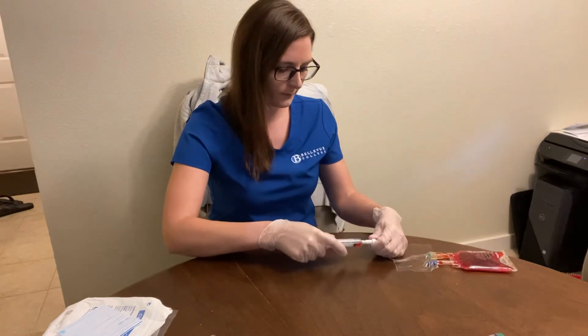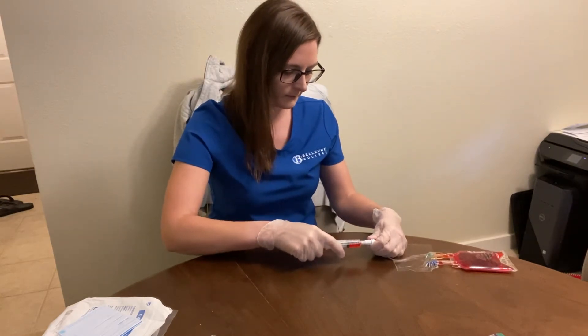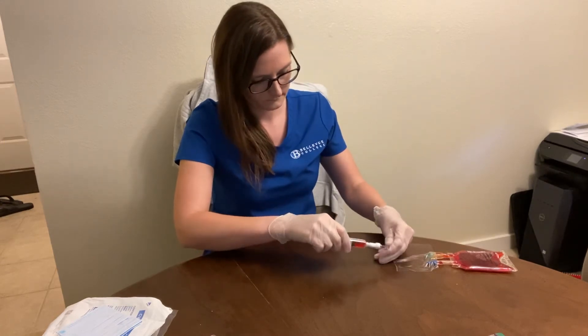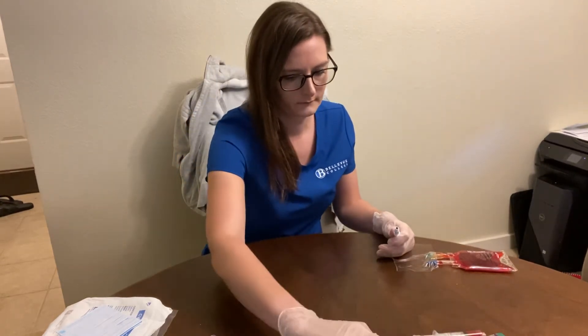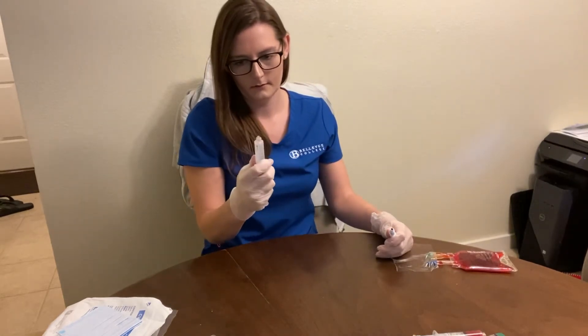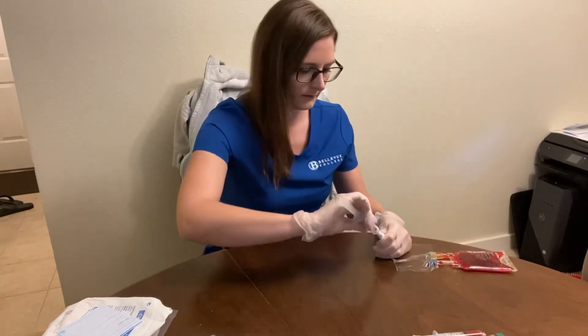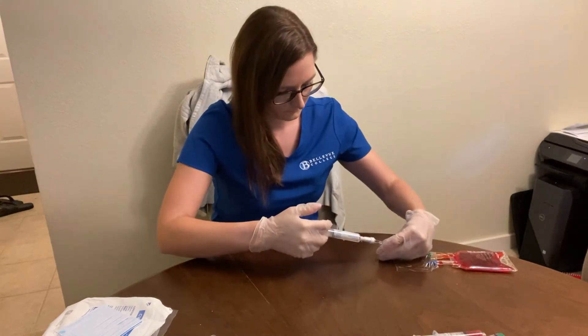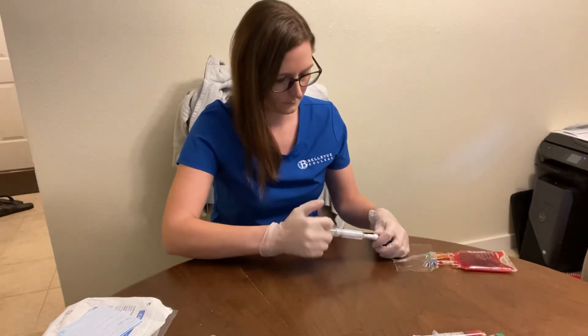I'm going to do my blood draw — about 4.5 ml. I'm going to set that to the side. Then I'm going to do 20 ml of saline flush, pulsing.